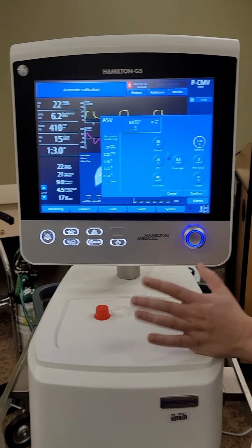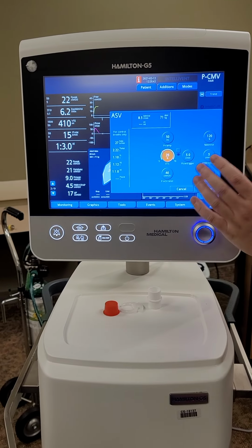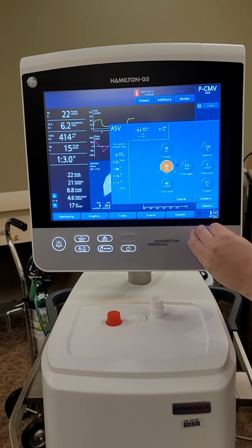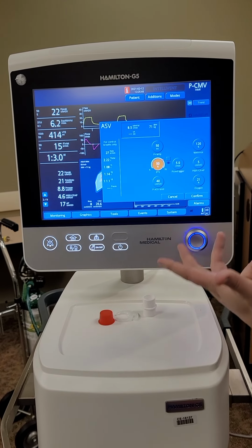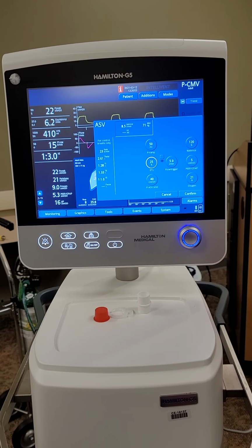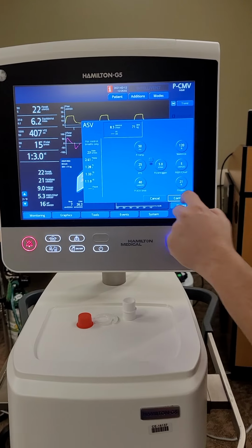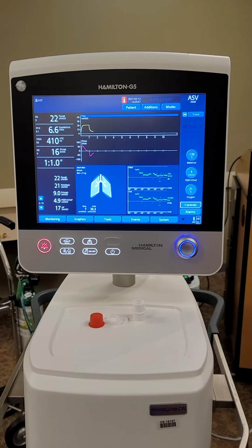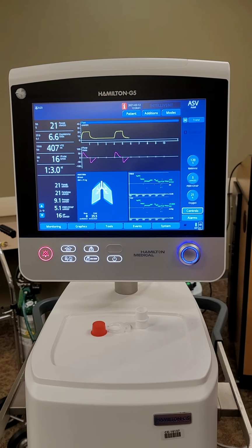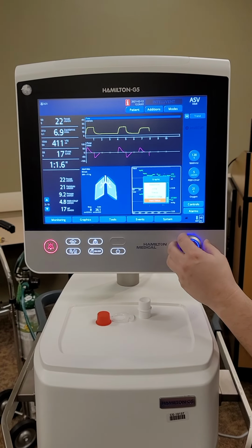If you want to be successful with it, if you have an ARDS patient, you turn this down. If you have a COPD patient, you turn it up. Or a retainer, I would say. Can you explain why? Yeah, so again, this mode looks at an expiratory time constant. So this is an ARDS type of profile.